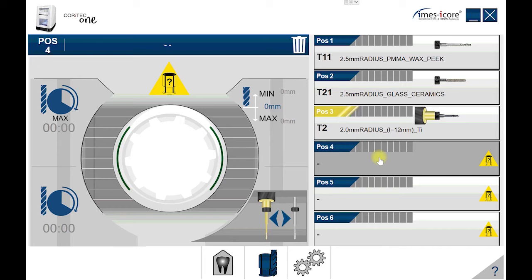The first area when defining a new tool is the max tool life display. This will show the maximum time the tool has to be used. Under this display, you will see the time spent on the tool, which should be reading 0 for new tools. Across from the max tool life display, you will see the minimum and maximum length of the tool. This area will also display the exact tool length once it has been measured.